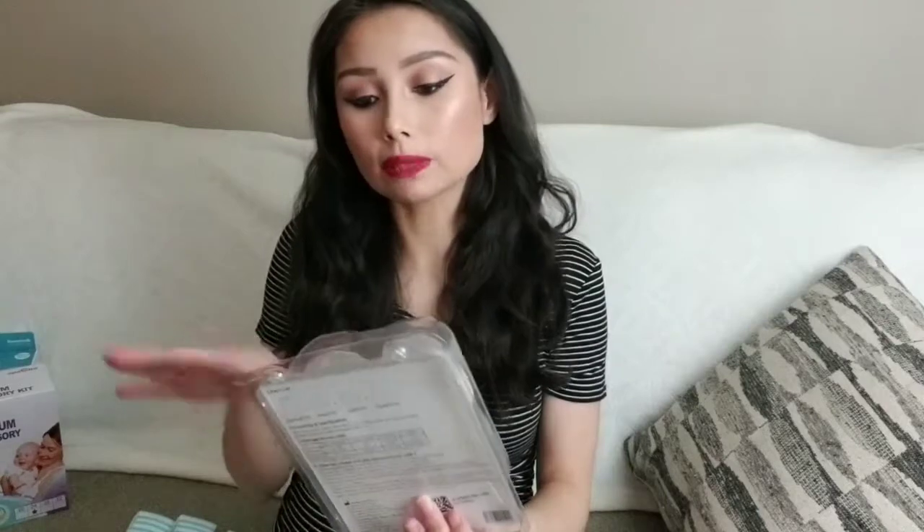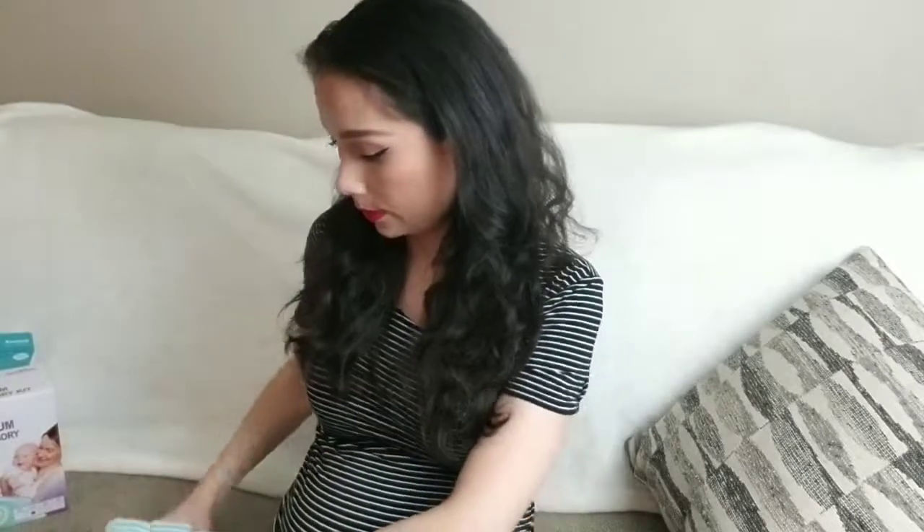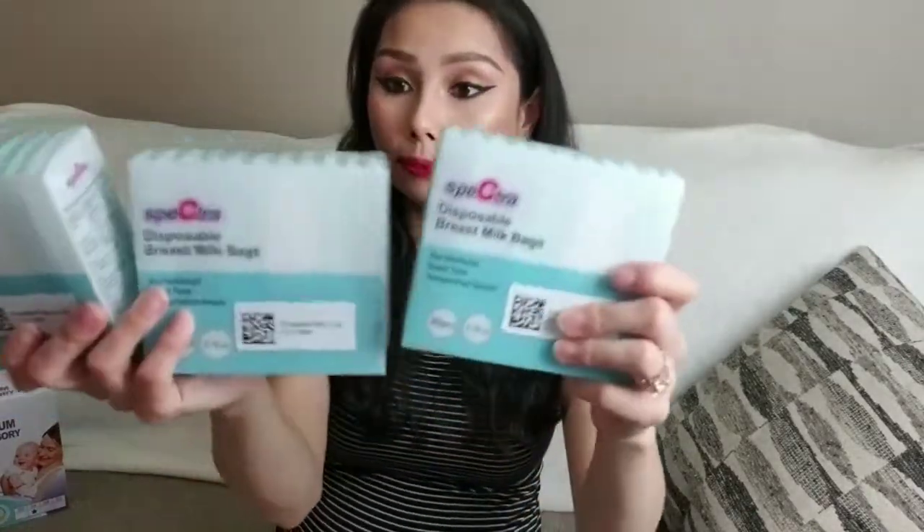I just went through the list and picked what I wanted since it's all free. From the same brand there are also two Spectra breast milk storage bottles. Then there are some disposable breast milk bags — 30 pieces per pack and three packs, so 90 total. I've seen this brand before, I think at Target or Walmart — three of these packs.